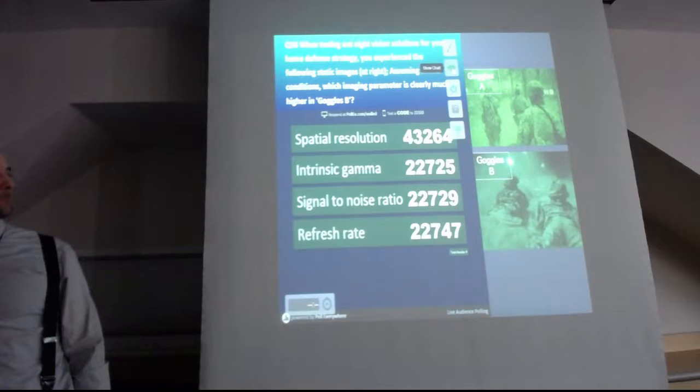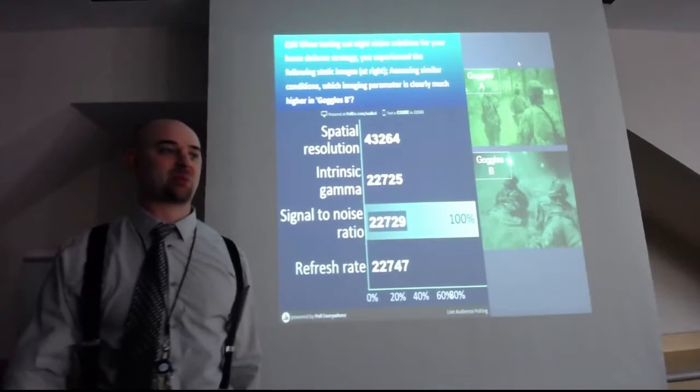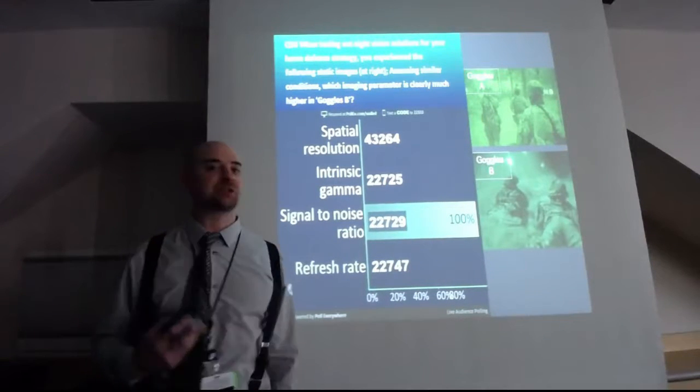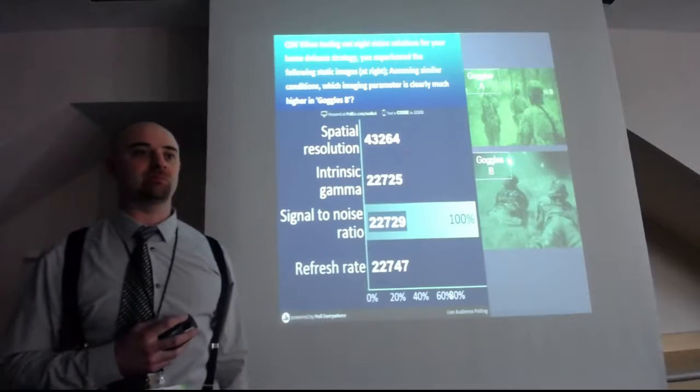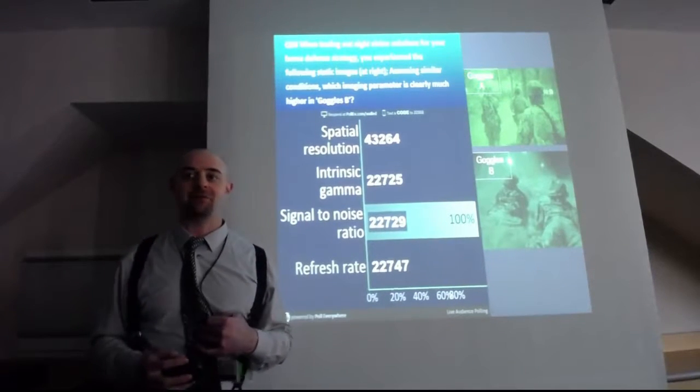Okay, so 100% of people said signal-to-noise ratio. That's very good. I'm actually really impressed. People are often tempted to say, well, goggles B looks better, and so they are tempted to say the spatial resolution's higher, but I see that I've taught you guys well, so very good.